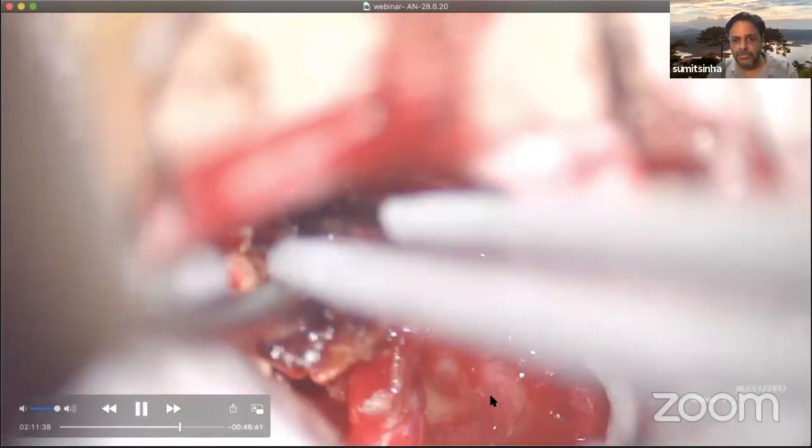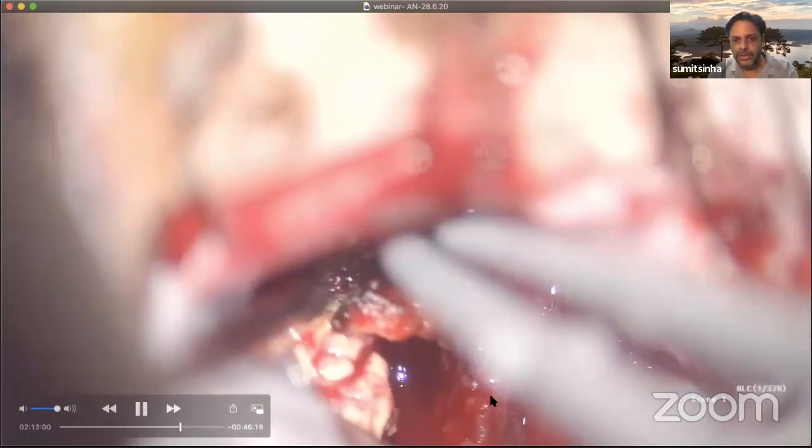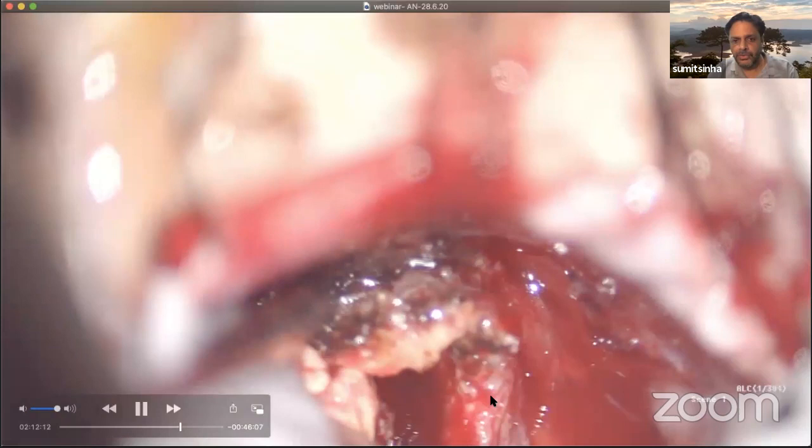So then some more debulking after separating the facial nerve, some more debulking from the porus side. I need to skip this.